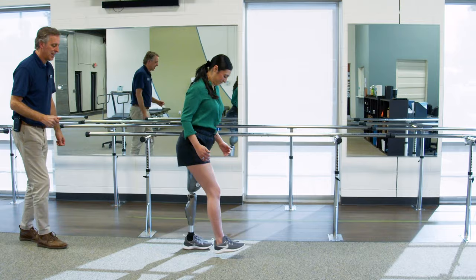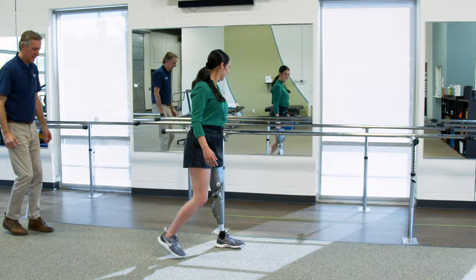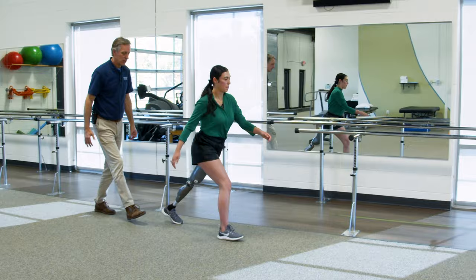Good. Hold, and backwards. Walk backwards. A little bit wider. Exactly. Good. A little bit wider. Excellent. That's good. A little bit narrower. Good. Now giant step forward. Good. The normal step. And hold. Turn around and come back to me.